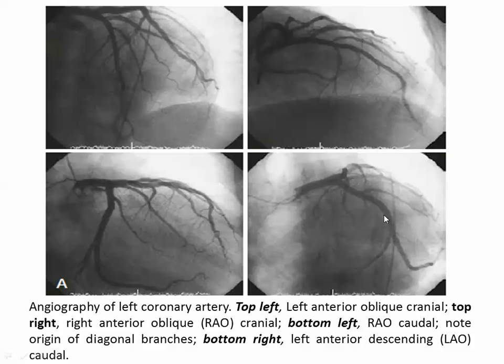It's LAO, so it is on the left of the patient. This is our mnemonic. And this is the LAD, it is rising and going down to supply the septum here. Can you comment on this LAD? No. Just the ostium or proximal part. No middle, no distal, anything.